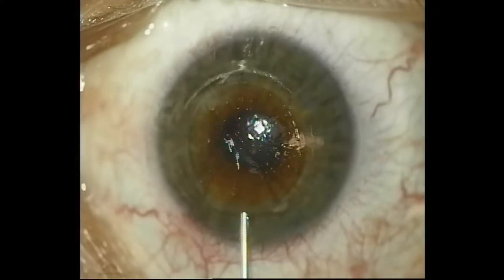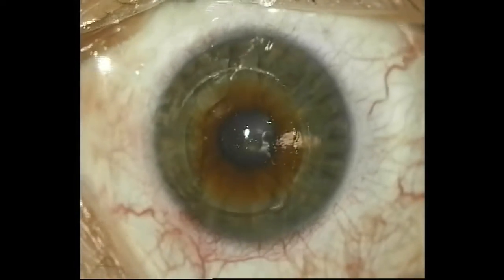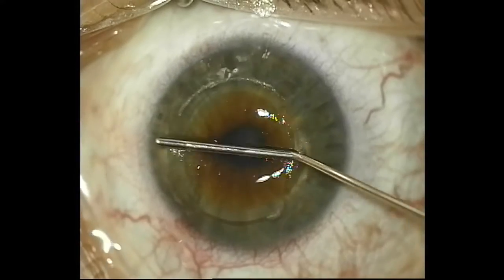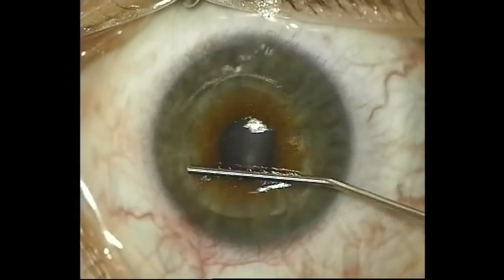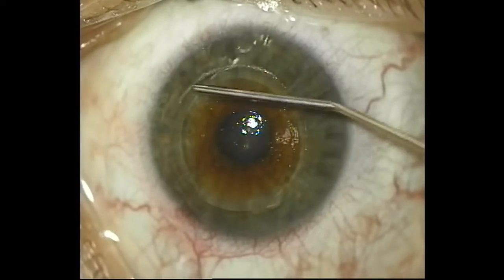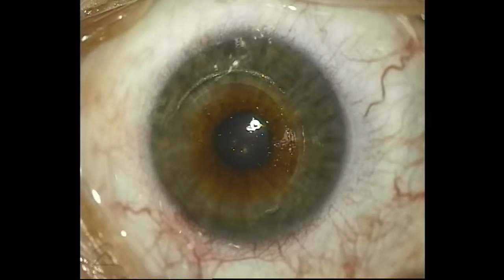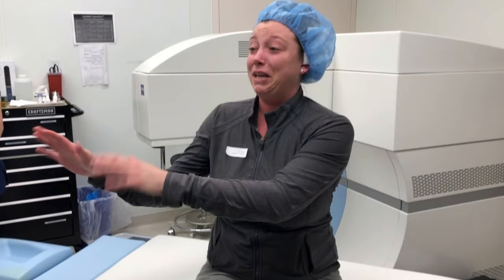The wow factor: we're done. I'll flush it out a little and squeegee out some of the fluid — but the fact that you don't have to go back and reposition a flap, you're just done. No second laser, no moving the patient to a different bed. To me, that was an incredible wow factor after doing so many PRK and LASIK patients. Our patient is now telling us how happy she is. She's a minus 8.5 and she just can't believe she can see everybody — she's so comfortable. At the end of the day, happy patients are the bottom line.